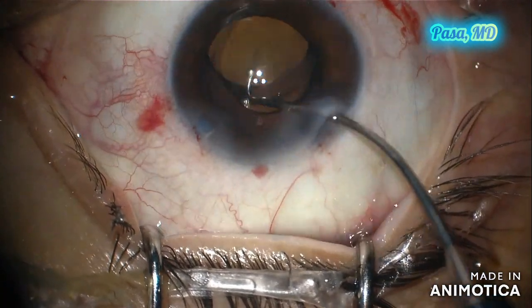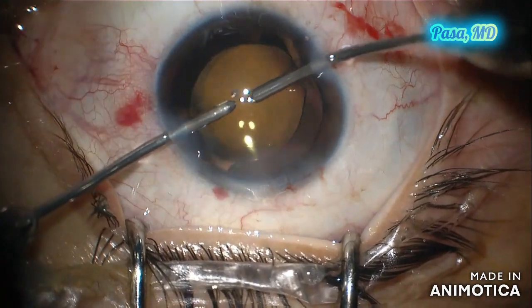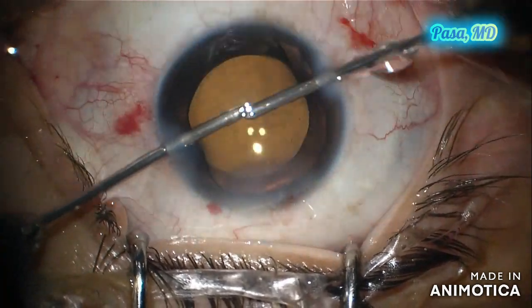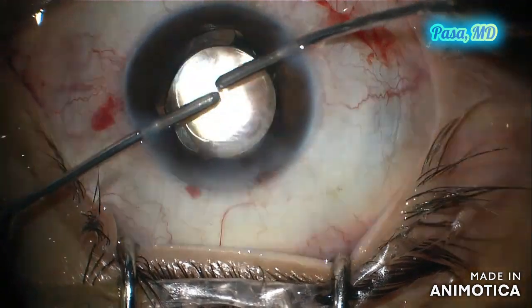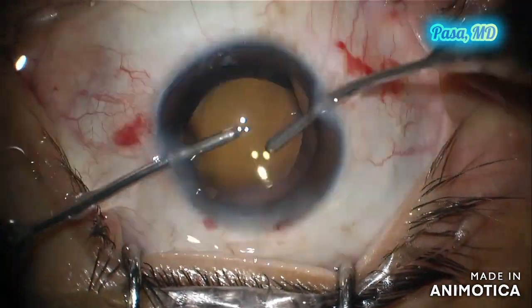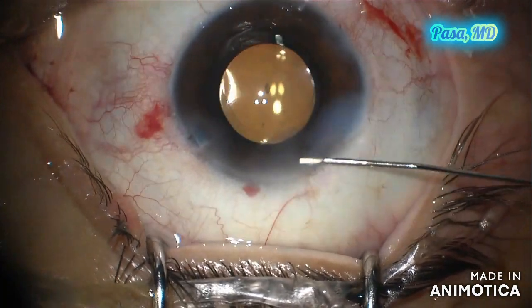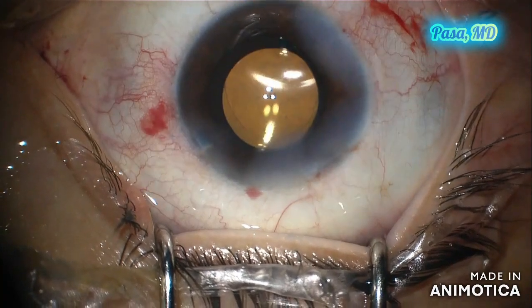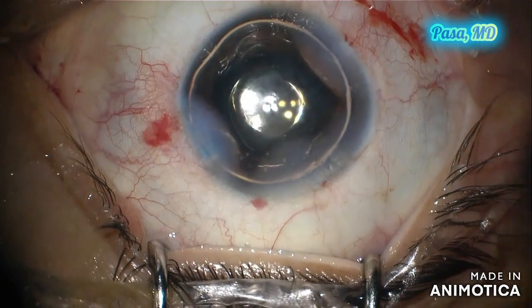Now injecting the IOL, then removing the viscoelastic with irrigation and aspiration, and hydrating the wounds — this case is almost over. You will reach the point where cataract surgery is very routine. As an ophthalmologist, this is the most common and frequent procedure in your daily life. If you move to private practice with demanding patients, topical anesthesia becomes essential. Thank you so much for watching, and have a great day.